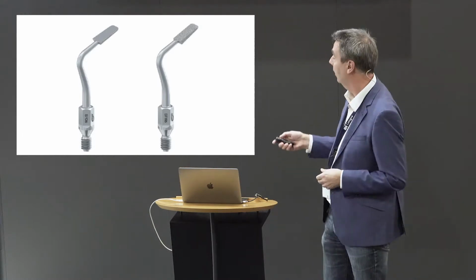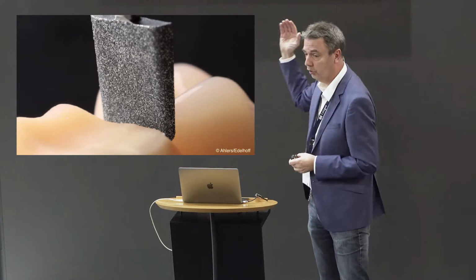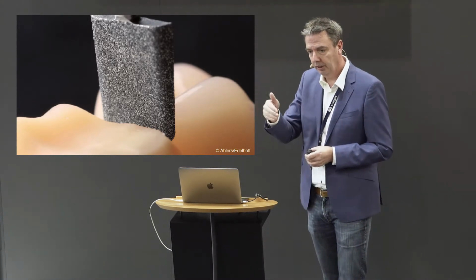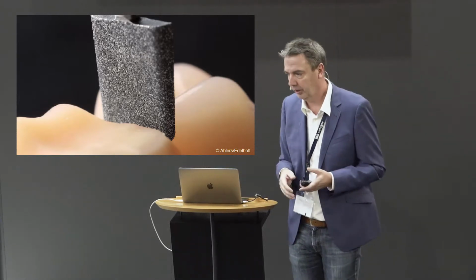So, like here, it's very easy to go through to create a really nice finish line without damaging anything. And that's what I try to perform.